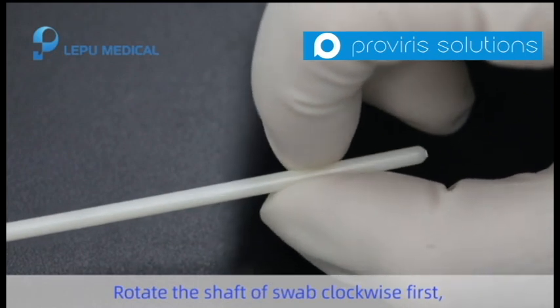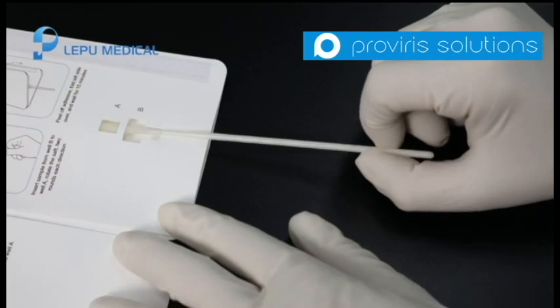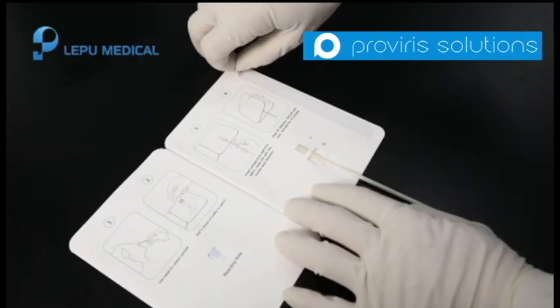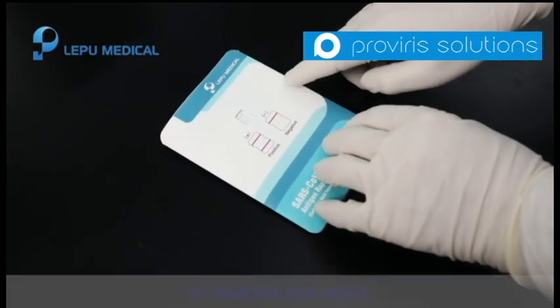Rotate the shaft of the swab clockwise first and counterclockwise, two rounds in each direction. Peel off the adhesive strip and fold the left side over, and wait 15 minutes for the test results.